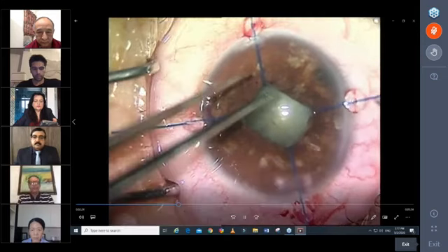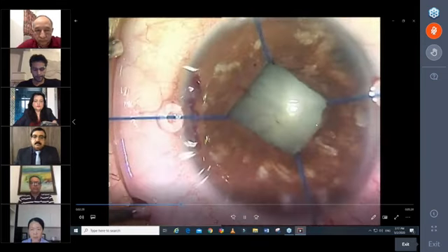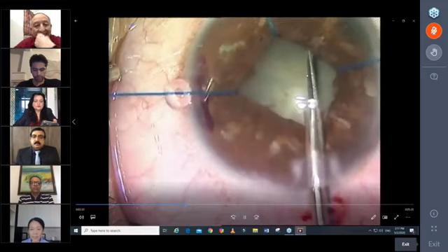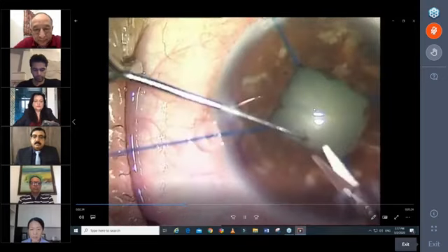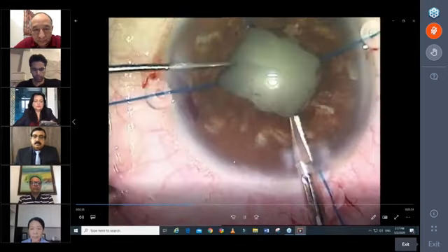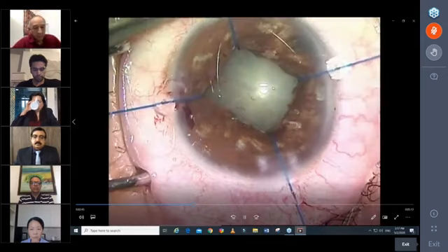And you can see here, when I try to expand this pupil a little further, it starts to rip here. And so I'm a bit worried because this is a chronically inflamed iris and it does not stretch nicely. All right, there's fibrous tissue and that doesn't stretch, unlike muscle. So in this case, this is the time to do sphincterotomies, and just small ones, just at the sphincter, so that the pupil can still remain reactive after the surgery, and the pupil will still remain round.